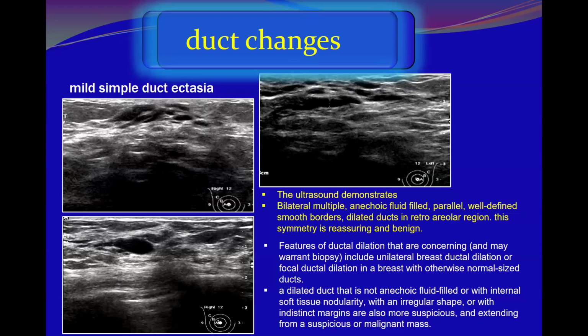We have mentioned that in postmenopausal women, after involution at the beginning, the ducts, due to fibrosis, will get dilated, and later the duct itself involutes and becomes fibrosed, attenuated, and disappears. If you remember that. So at one stage, as a normal physiological process, we can see ductal dilatations.